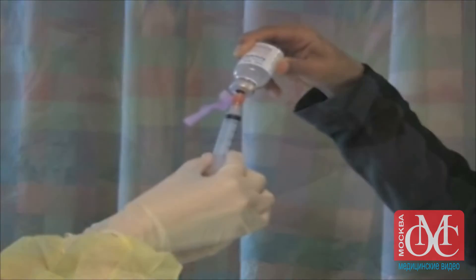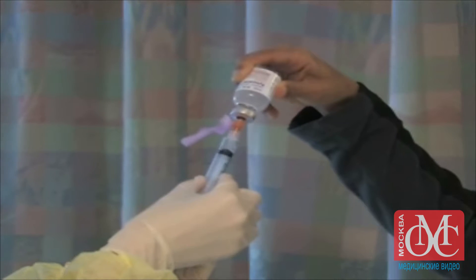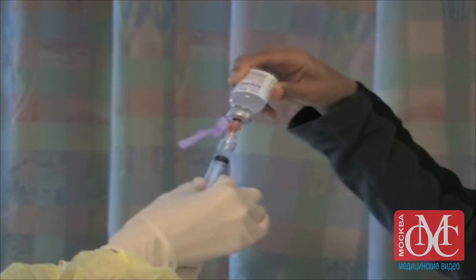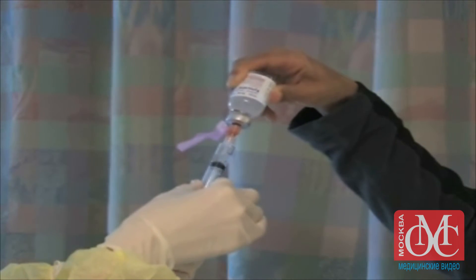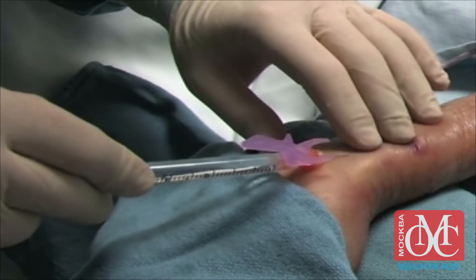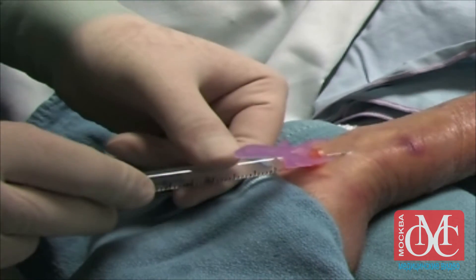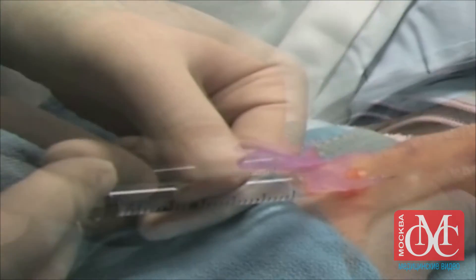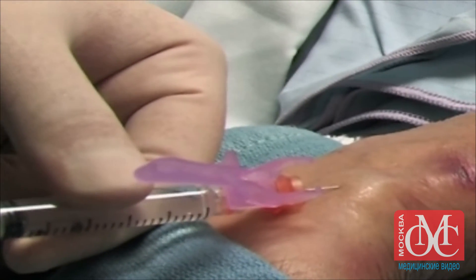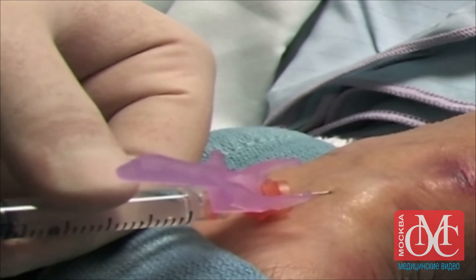Using the 5cc syringe and small needle, draw up 1% lidocaine. Upon introducing the needle under the skin, draw back on the plunger to ensure that you have not punctured a vessel. Inject a small wheal of analgesic around the artery and wait 30 to 60 seconds for the lidocaine to take effect.